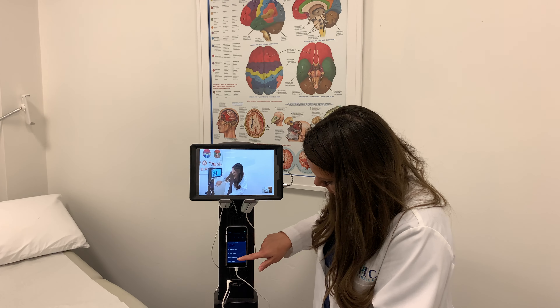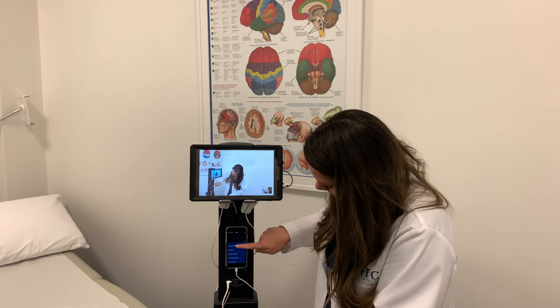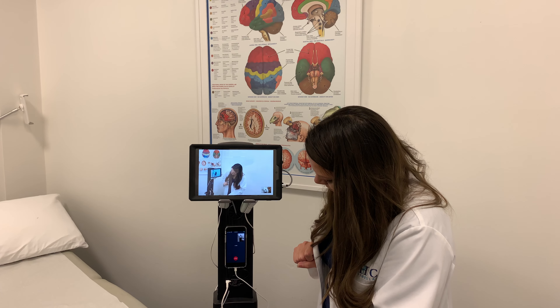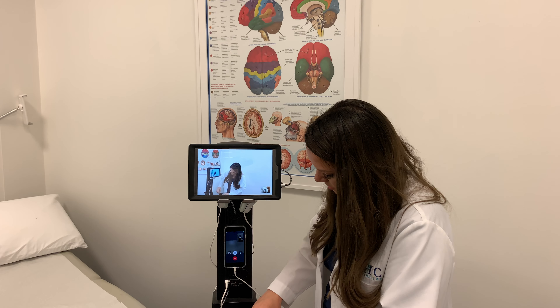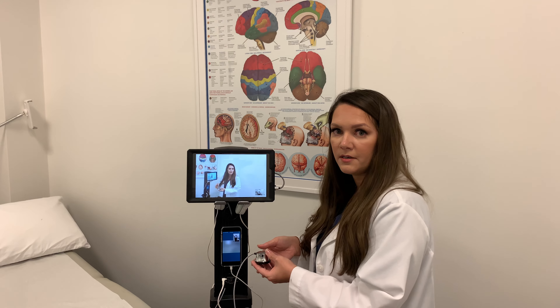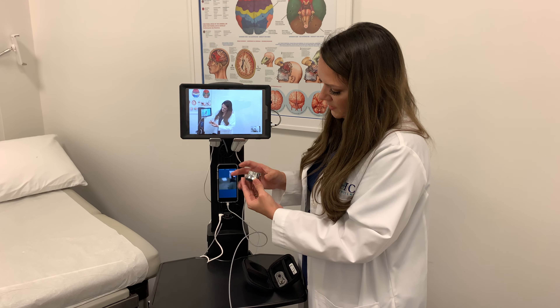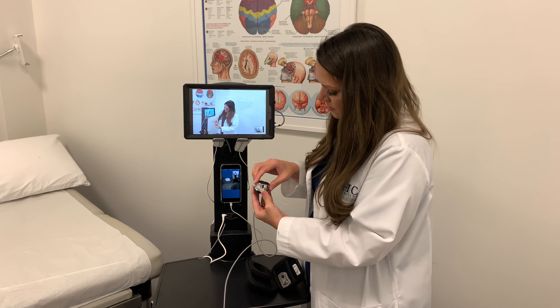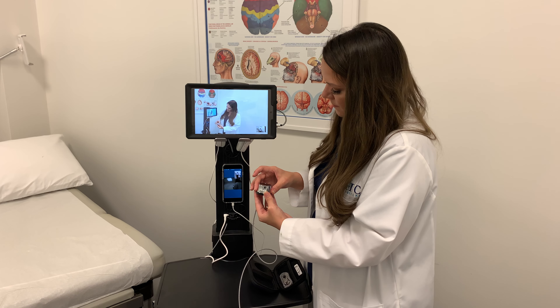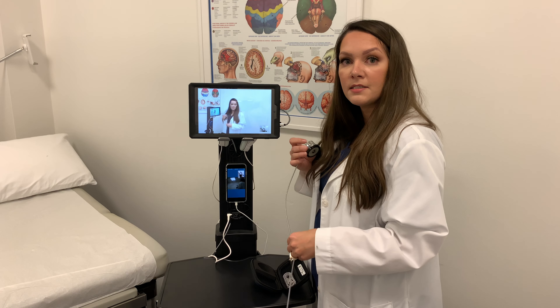CMS only requires a two-interface device, meaning you can see them, you can hear them, and vice versa. We have something additional to that — we have a stethoscope. To turn that on, you're going to click the button on the iPhone that's already connected to the station, and the same way that we connected here, we're going to connect here also. There should be a drop-in button, and if you were connecting to me again it would be Crystal Jaynes Stethoscope, because this is the stethoscope that we're using.